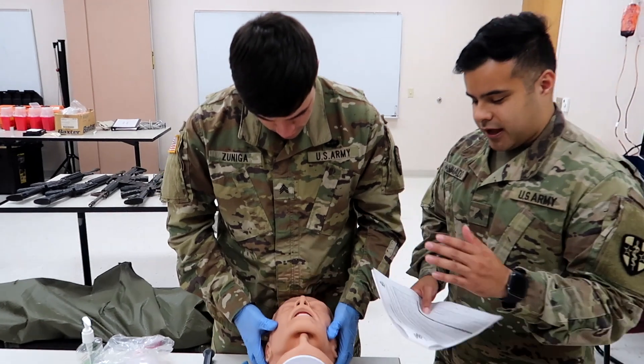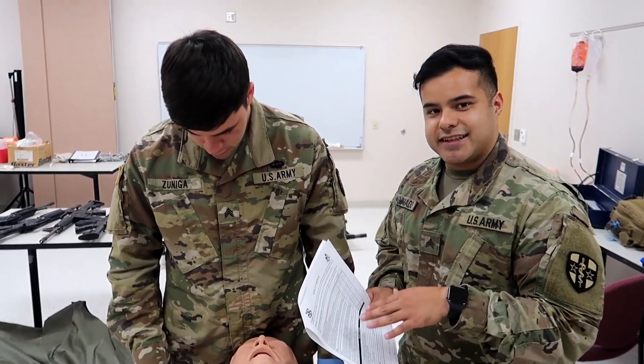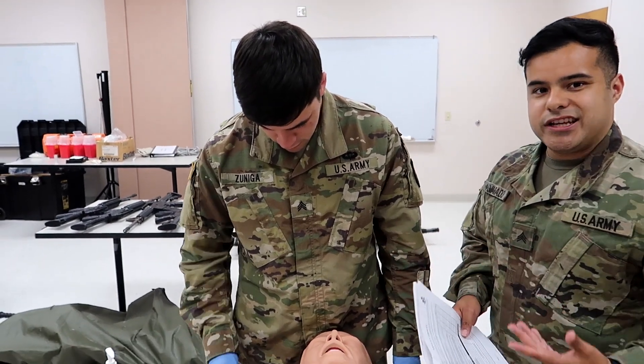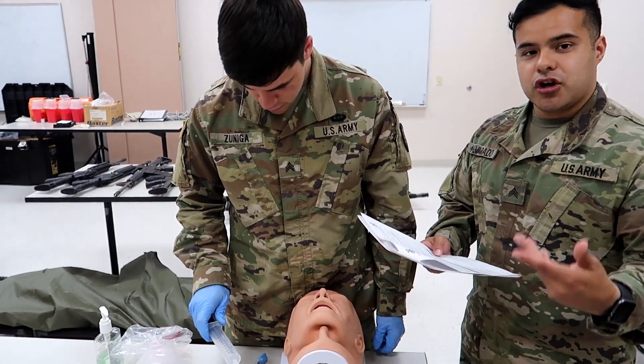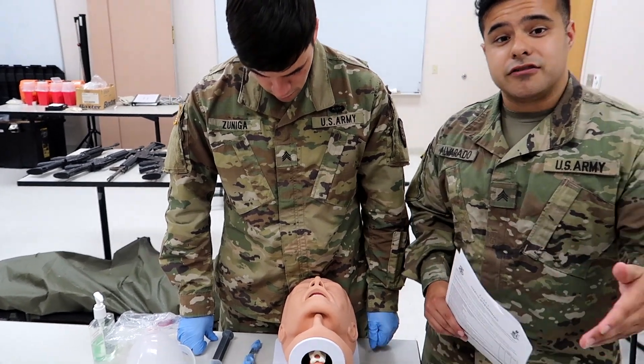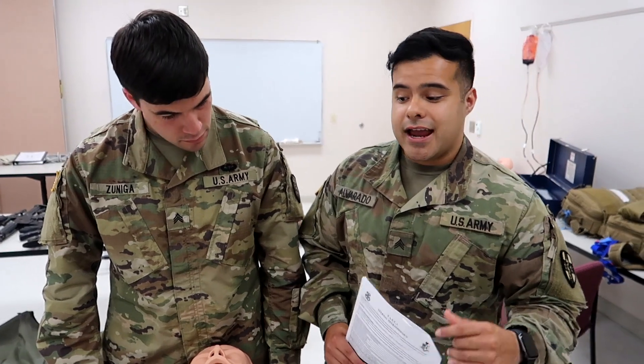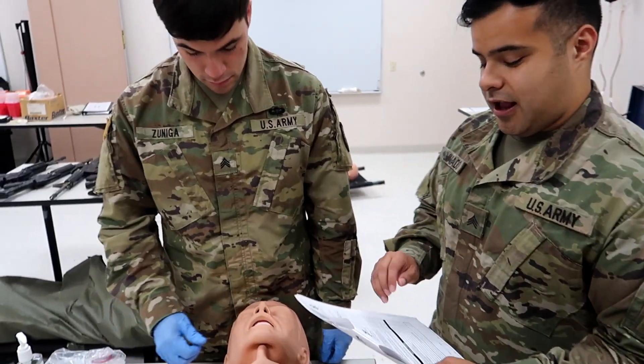All right guys, so here we are. We got our mannequin right here. I got the steps and I'm going to be going step by step. As I do that, he's going to be performing what he needs to perform in order to show you guys the proper way to do it. Take this with a grain of salt — if your instructors tell you to do different, follow what they say. They know how they're going to grade you, and they probably know a little more than we do. Without further ado, let's knock it out.